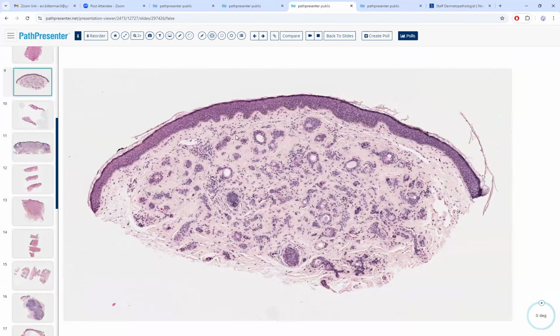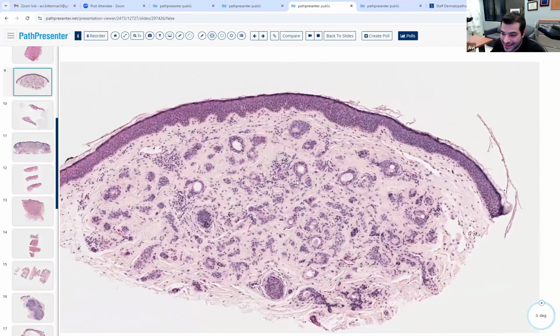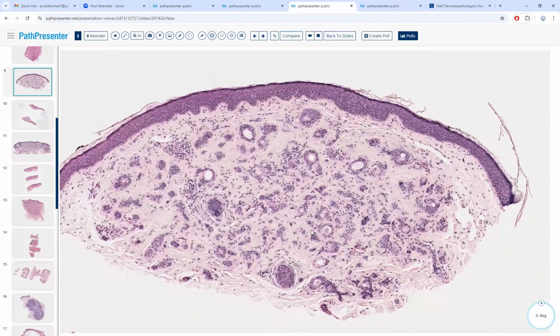It's more benign. You see the Paisley tie differential, even just from low power view. It's a bunch of ducts. Yeah. Okay, so we see Paisley tie, and you see the ducts. Looks like it's seeing a hair, could be like an eyelid or something.